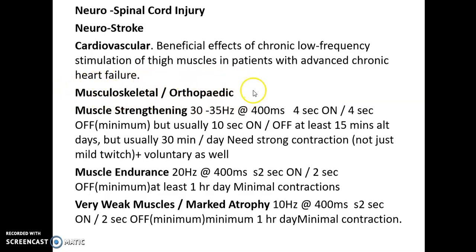In cases where people are having, here also cardiovascular heart, we are talking about if the person has a pacemaker or any kind of metal implant, you cannot apply that in that area. Maybe another area you can apply, but not in the area where the electrodes are placed and the current will be passing through. So three things we have to think about.